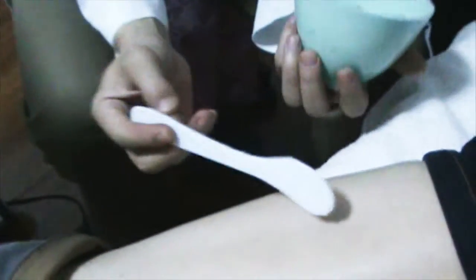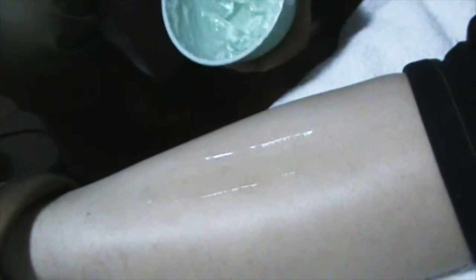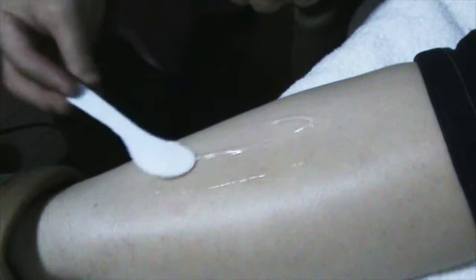It's okay. Clean in this place before treatment. Actually, we can use one or two millimeter jelly on the skin. Maybe not so painful.